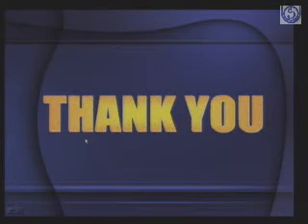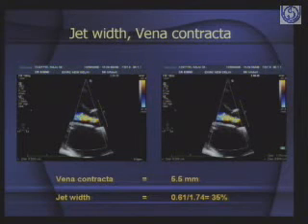So ladies and gentlemen, this is what I and Dr. Vinayak had to say. Now, since we have the next 8 to 10 minutes, gladly we'll take a few questions. And the idea here was not to dishearten you or to give too much data, but really to give you a good insight into how you can use echocardiography. But again and again we keep coming to the same theme, that clinical examination, good history taking is absolutely mandatory to send a patient up for surgery or to keep him in medical follow-up.